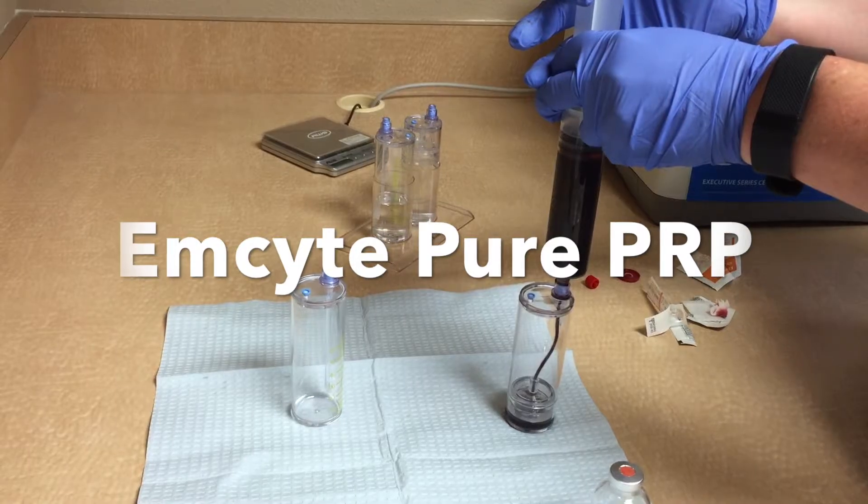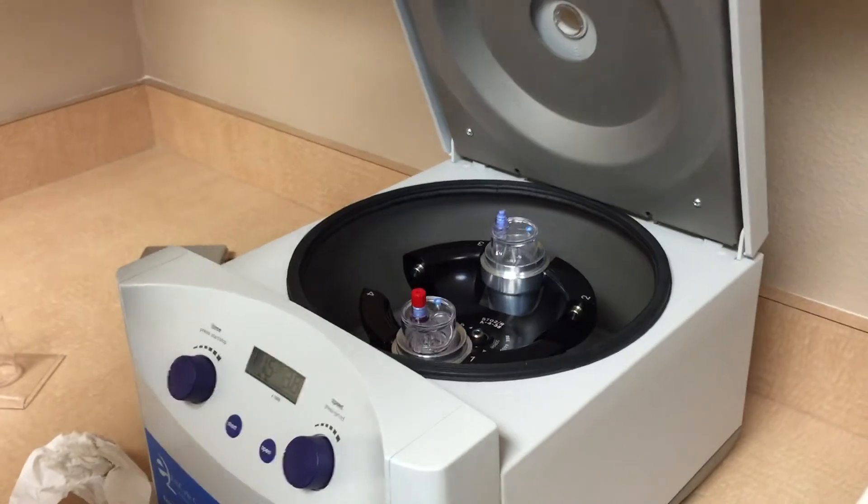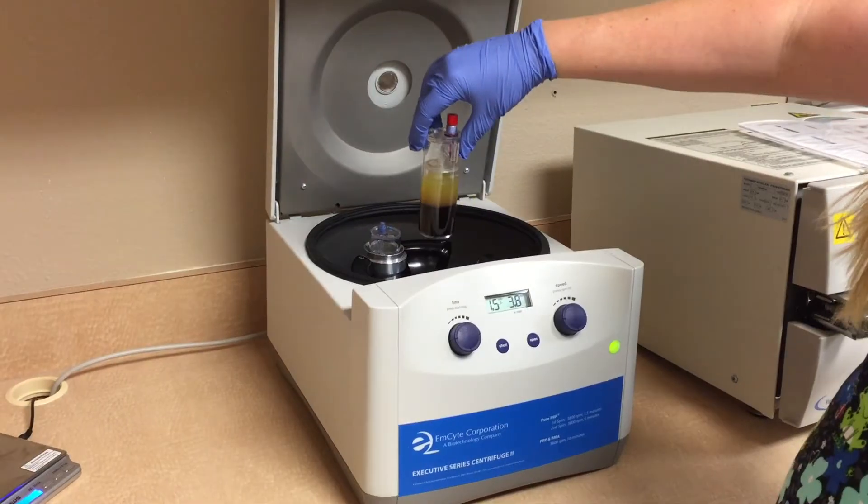Welcome back, this is Mark Muslin with Blackstone Health. Quick video comparing two separate PRP collecting systems.